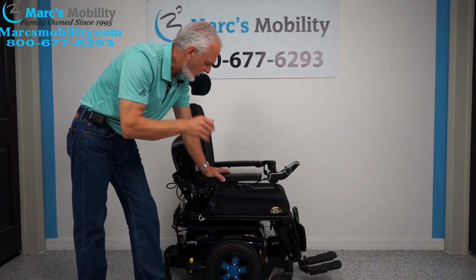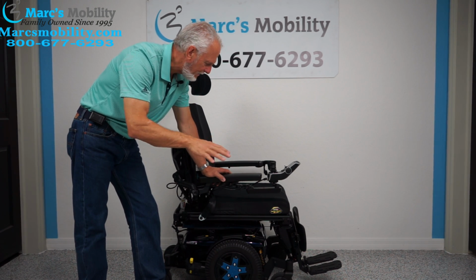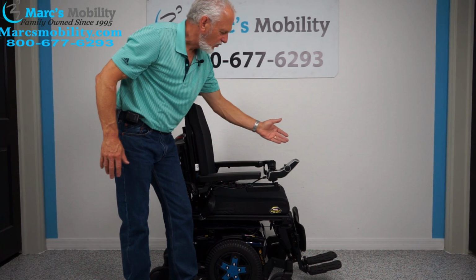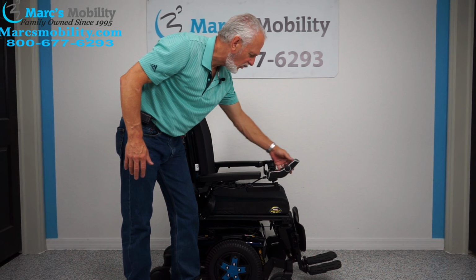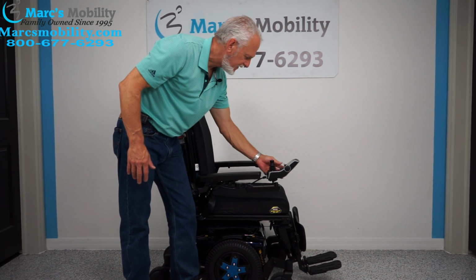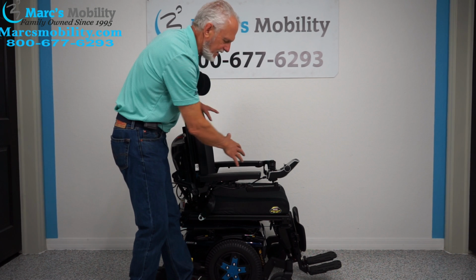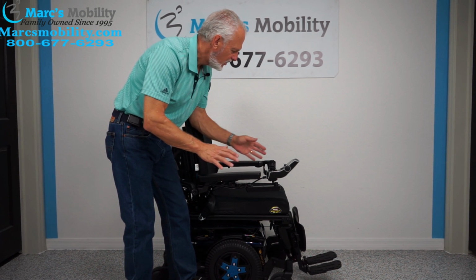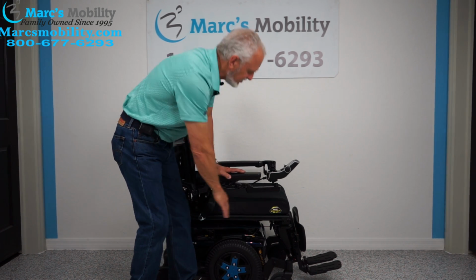But all the features on this chair, if you want to make the seat go up or tilt or recline and all that, you have to do it through the joystick. So you would use the button that's on the left side. It's got a knob on it, and keep pushing it forward until you see a picture of the seat. When you see a picture of your seat on the screen, whatever is yellow is the function that's going to be working. So all I want right now, I want to start with a seat lift. I want just the bottom cushion to be yellow.